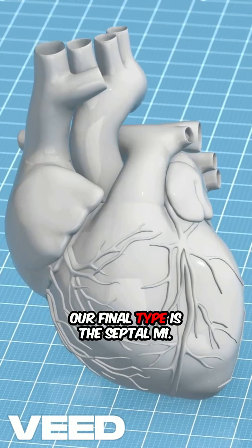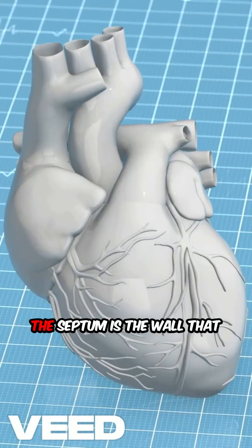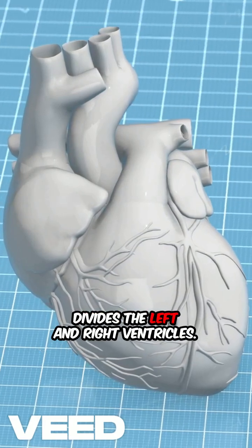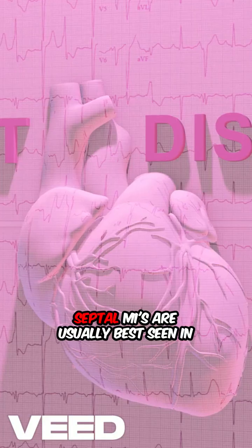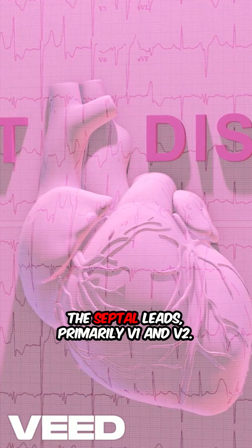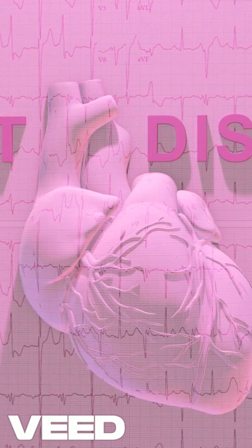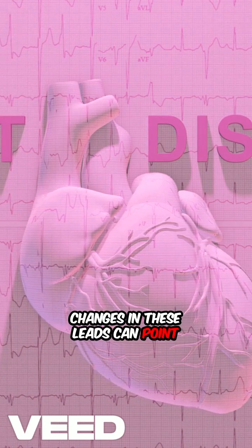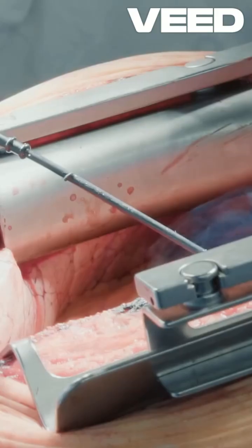Our final type is the septal MI. The septum is the wall that divides the left and right ventricles. Septal MIs are usually best seen in the septal leads, primarily V1 and V2. Changes in these leads can point towards damage in this crucial area.